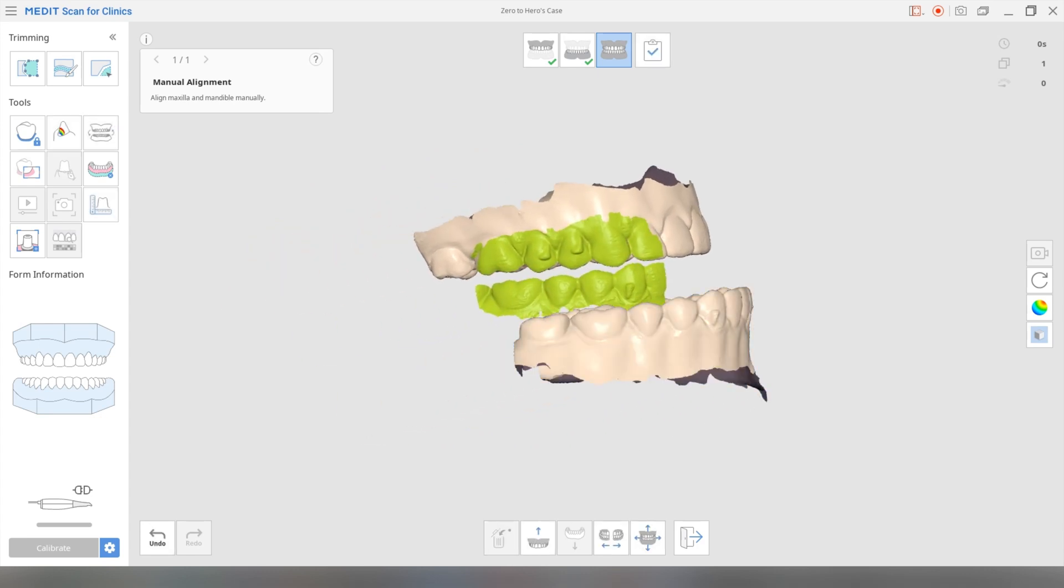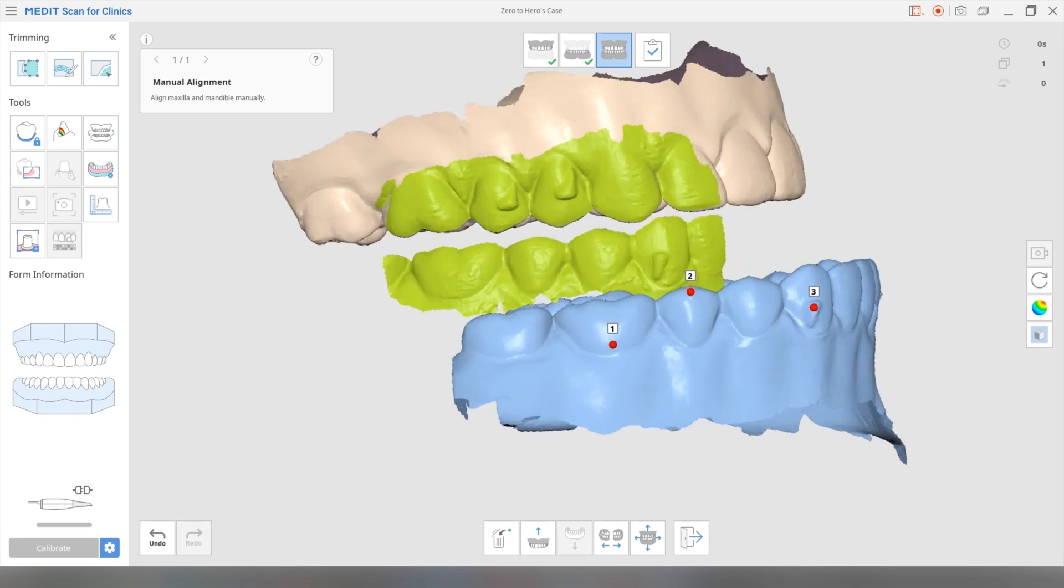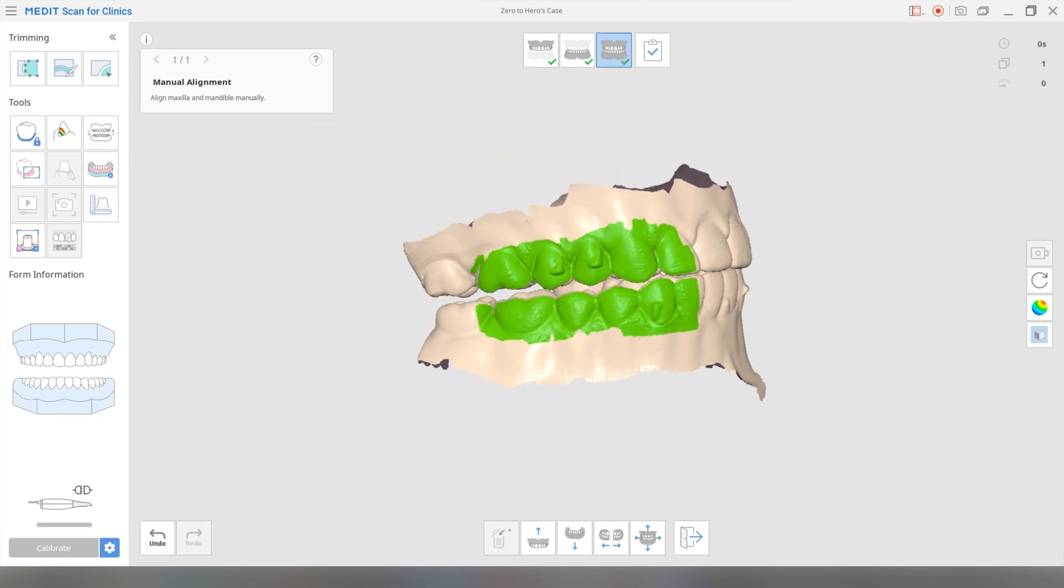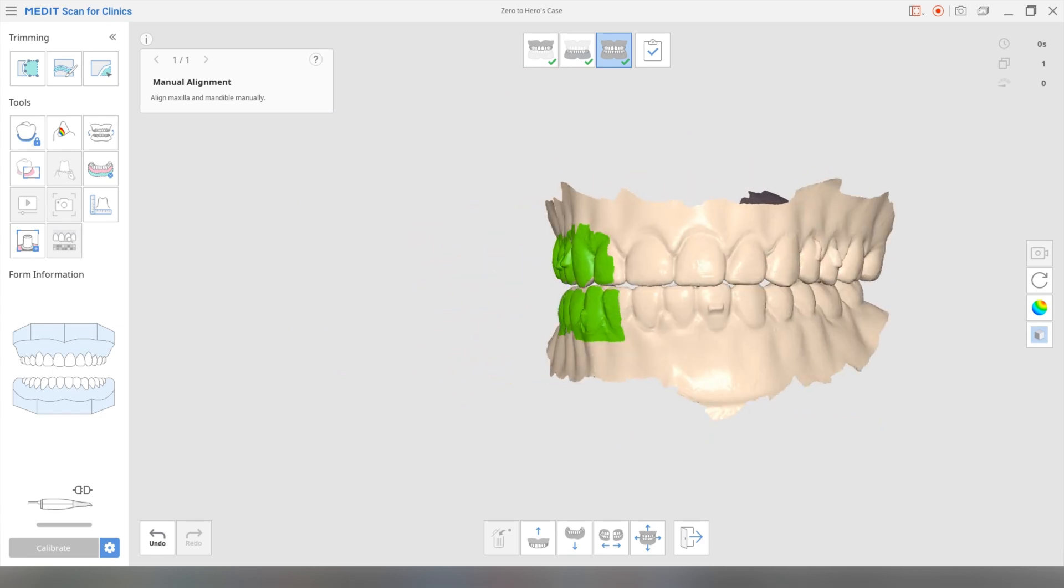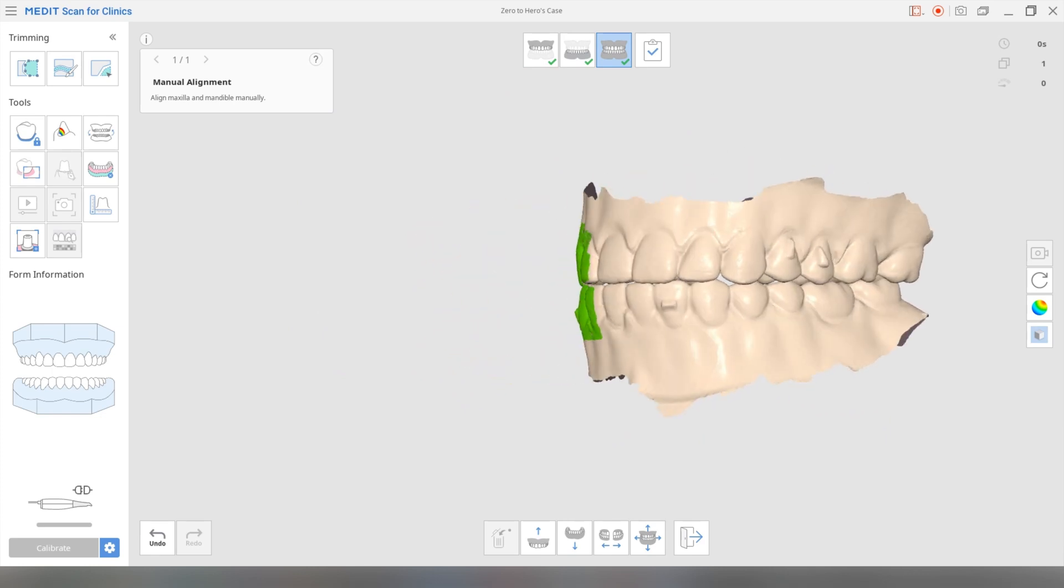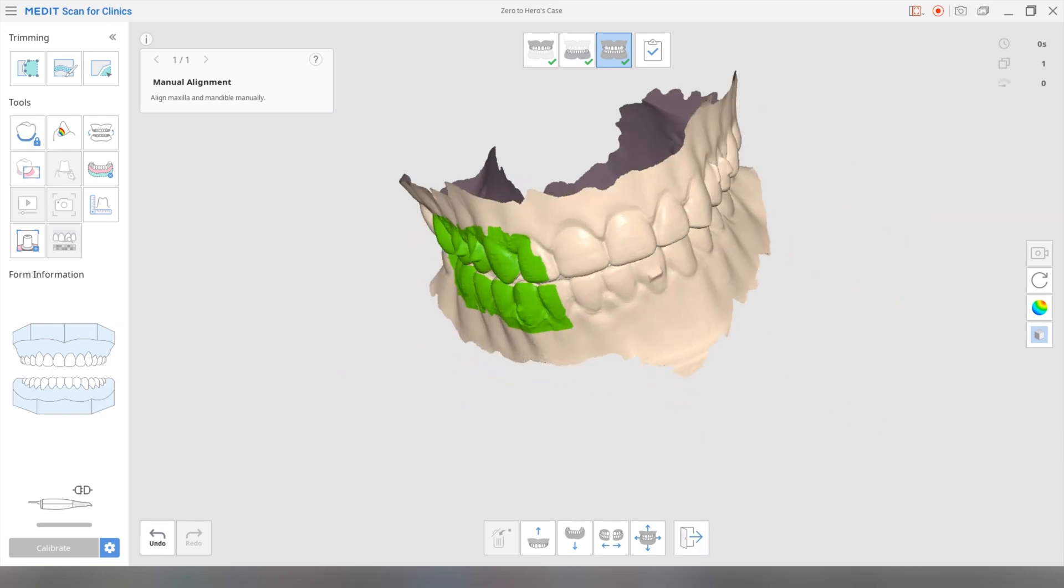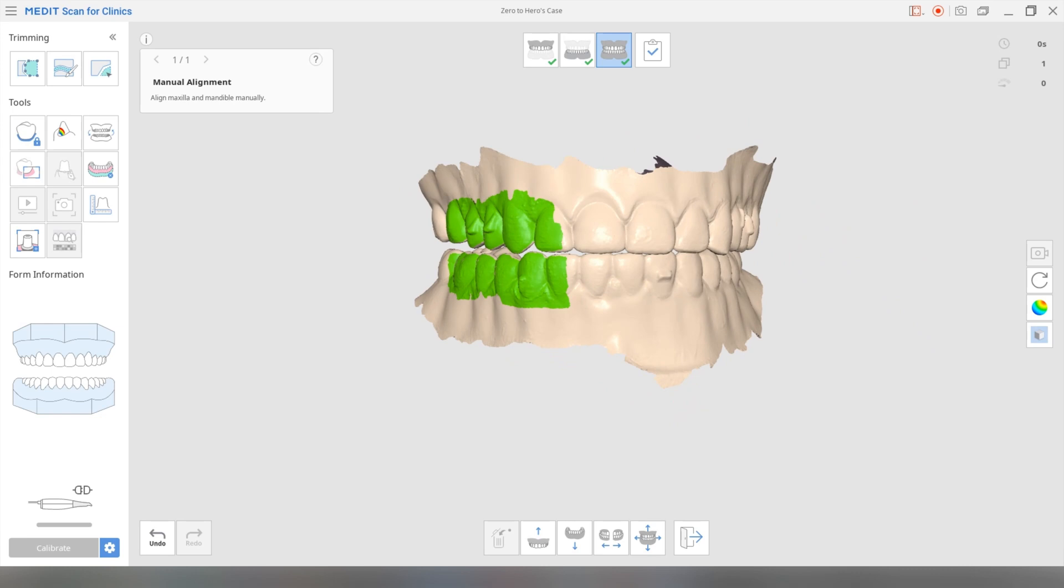And then you're going to do exactly the same for the bottom. So I'm going to pick one on this six at the gingival margin, cusp tip. I want to add the attachments. Scroll in to see a bit better. Once again, tip, edge, and attachment. It's going to line up. And there you go. Okay. So that's good. I'm happy with that side.